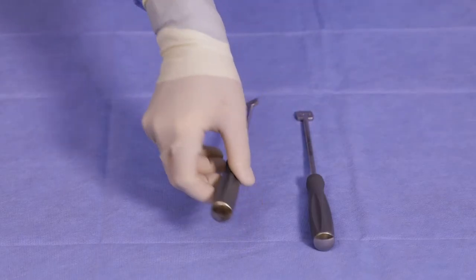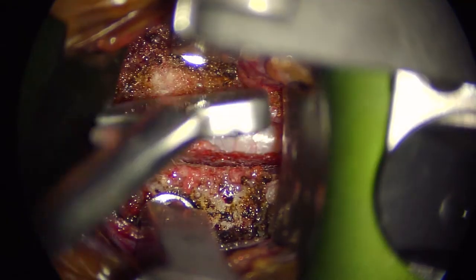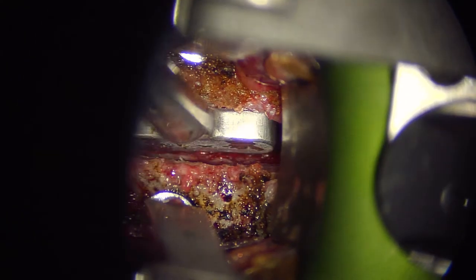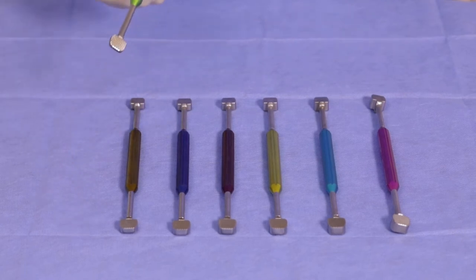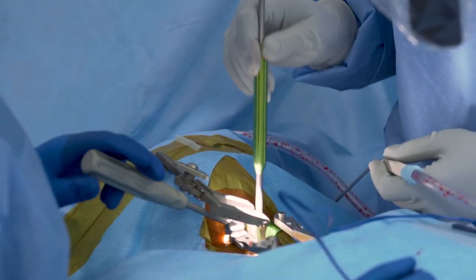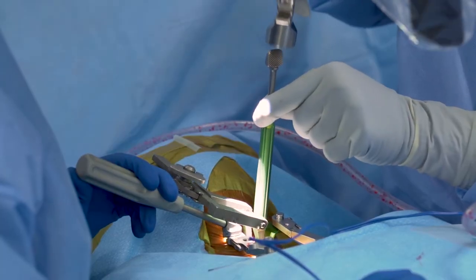Using the paddle sizers, insert the selected sizer into the disk space to determine the proper footprint. Once the footprint has been decided, use the trial to determine the implant height. Insert the smooth end of the trial into the disk space, stepping up in height until the desired fit is achieved.